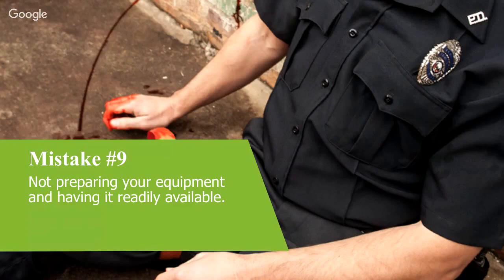Having them on the outside of your pack, not buried deep inside your trauma pack, so you are able to get them. So that's something we see. The longer it takes to get it, the more blood loss you're going to have. Again, Eric brings up a good point that his CATs are in the trunk of his cruiser.